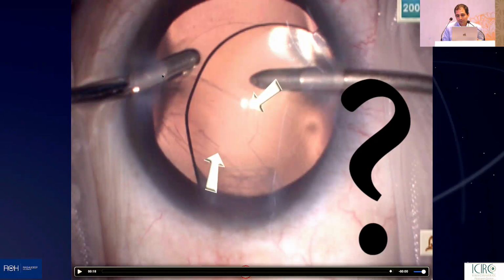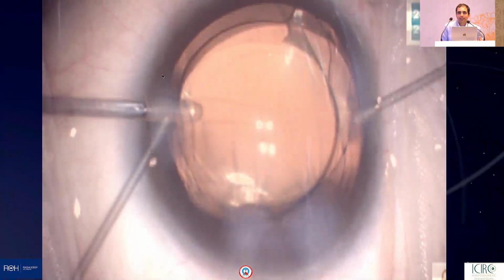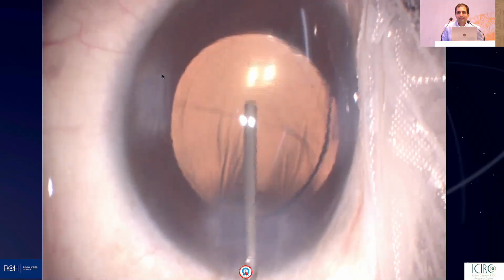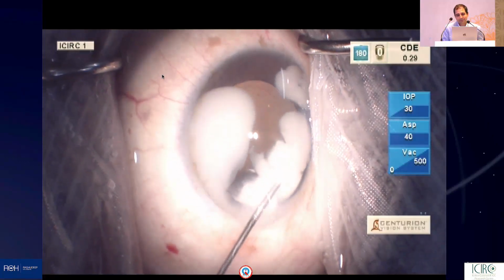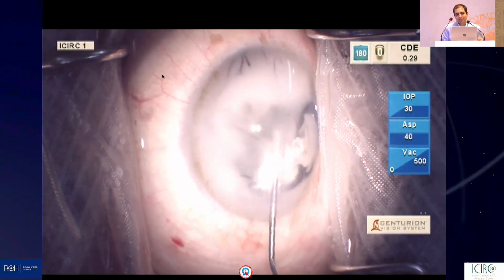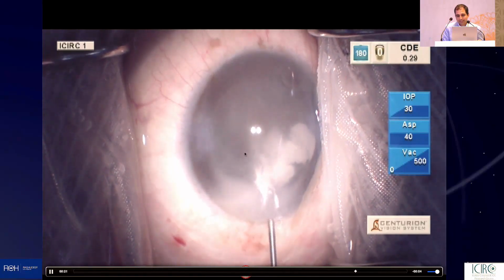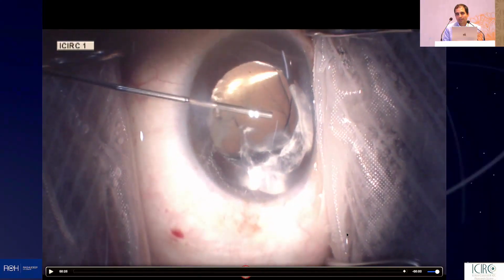So now what do you do? First of all, you pray that nobody has seen this and this has not happened. So that's what I did. I hydrated the wounds and I thought God is kind and this IOL will center. Nothing has happened. So I tried centering the IOL, didn't work. So eventually I had to take the decision, injected triamcinolone, and obviously with so much of currents of irrigation aspiration, the vitreous was disturbed, as you can see, and it's coming from the area of the PCR.